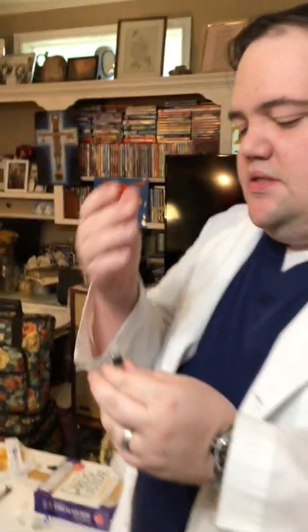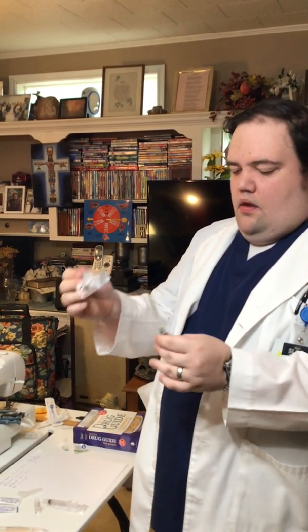I'm going to dispose of this needle because I can't use it because it's a filter needle. I'm going to take that off. I'm going to replace it with another needle, one that I'll use on the patient. And because this is a deep intramuscular injection, I'm using a 21 gauge needle. Pretty thick needle. Okay, that is ready to be administered.